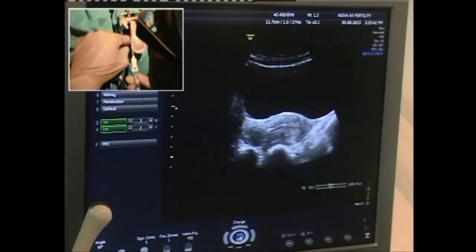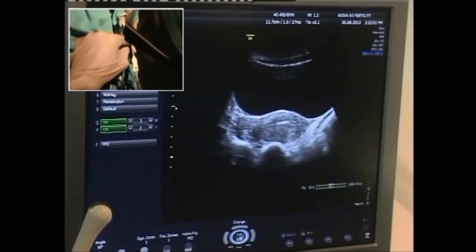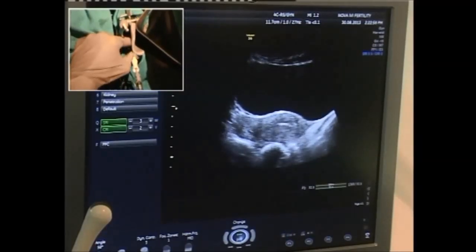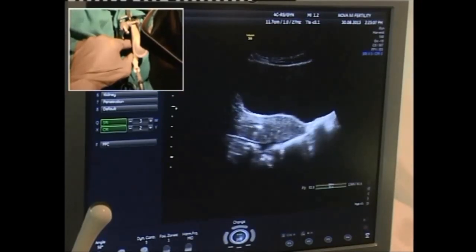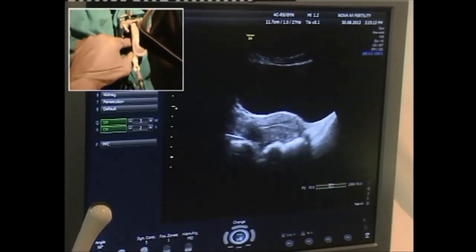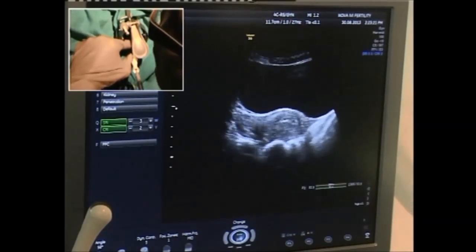We can see it now — going inside, reaching just a little below the fundus. It is going slightly subendometrial and we would like to see the tip clearly. I withdraw it slightly so that the distance is about a centimeter — this is where my outer is. We have to move our hands right and left and you have to have a very good assistant to be able to show you the tip.